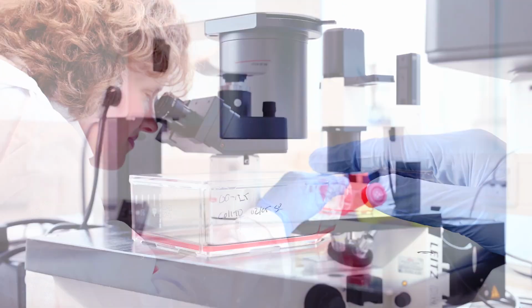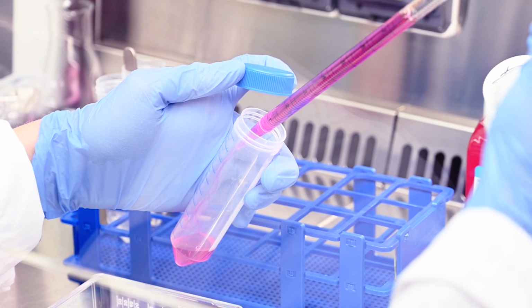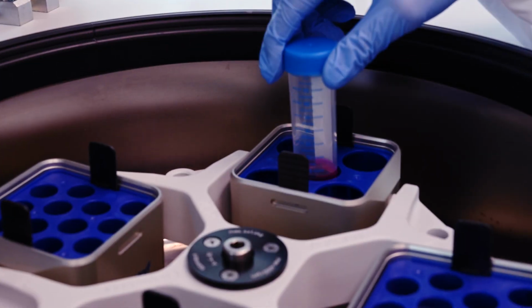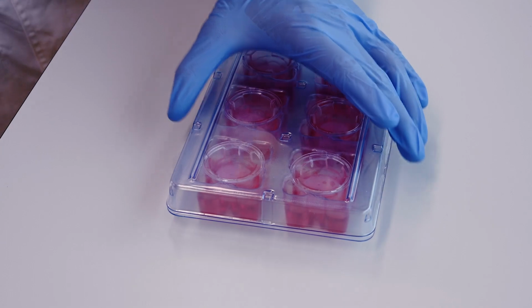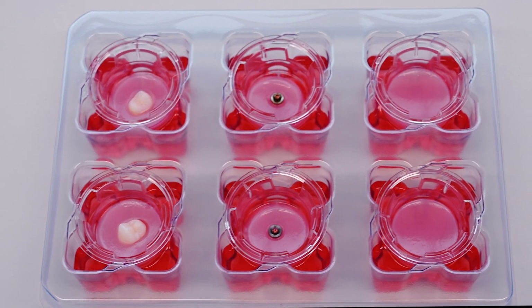actually use these to investigate host microbe interactions, that is interactions of our oral mucosa with potential pathogens, but also to look at how the abutments and the filling materials brought into the mouth interact with these soft tissues, potentially causing adverse effects. In our lab, we are actually world leaders in making organotypic mucosa.